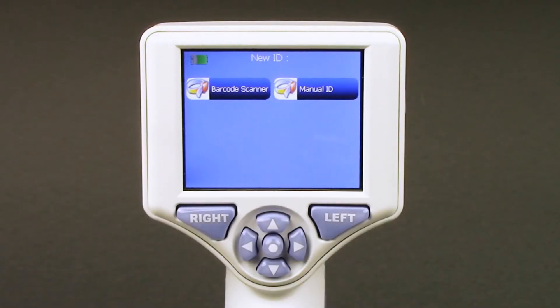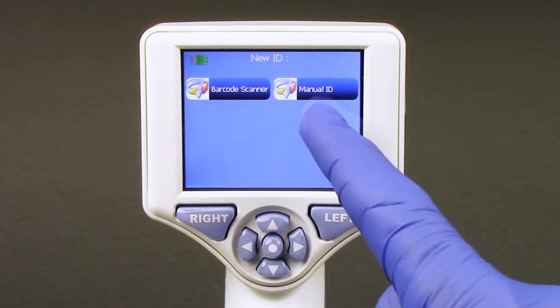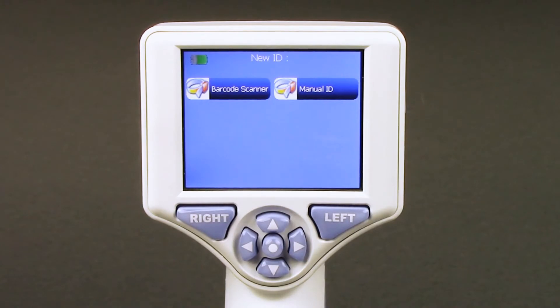Prior to the first patient measurement, the patient ID must be entered into the smart guard using either the barcode scanner or manual entry of the patient ID. The patient ID is only required to be entered into the smart guard on the initial setup.